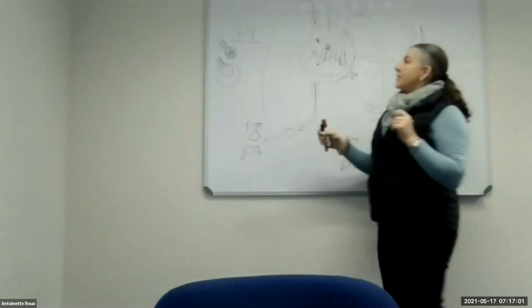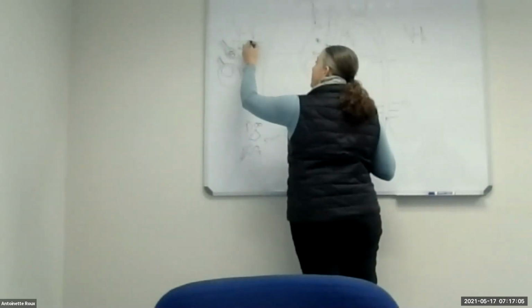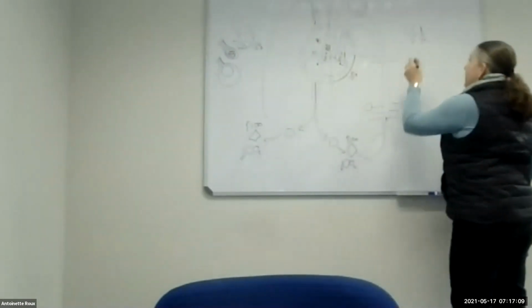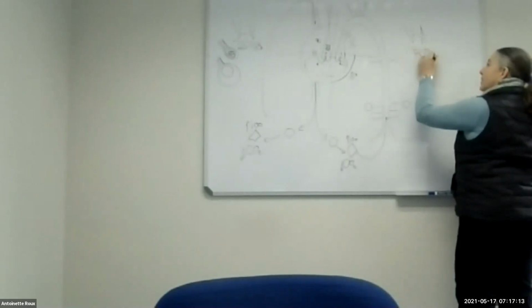So we have to take a certain percentage. In VV ECMO, we use 60 to 70% of that total blood flow that we will tell to our patient. And in VA ECMO, we start off with 80% of the total blood flow.